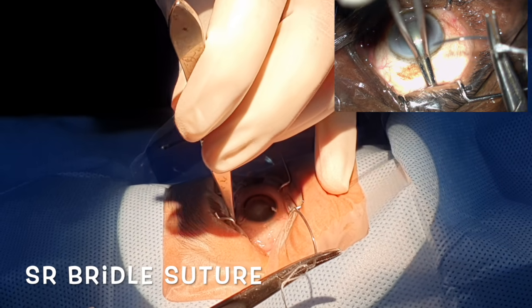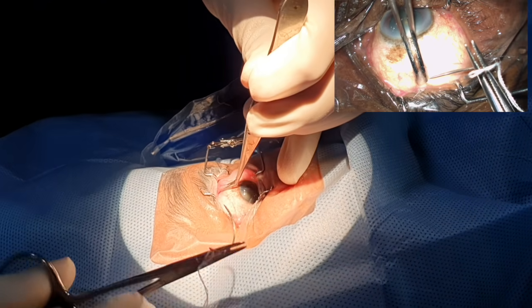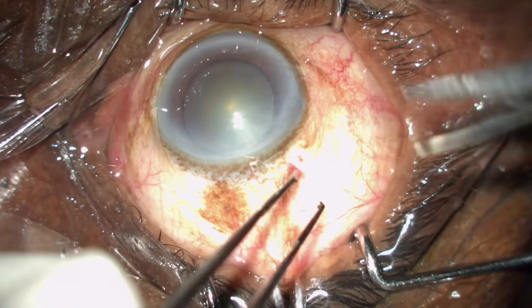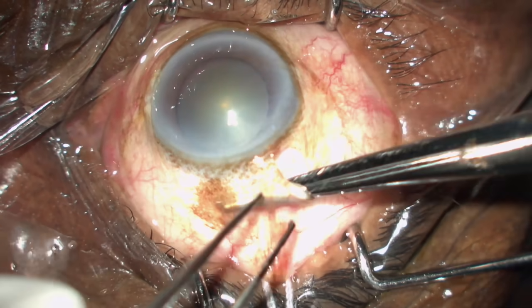Before doing the superior rectus, make sure you bend your hand, hold the rectus and pull it before you take a bite. Always give a two millimeter gap between the limbus before you hold, so that the tenons and the conjunctiva are held together, and with a single cut both are cut evenly so that you don't leave remnant tenons.